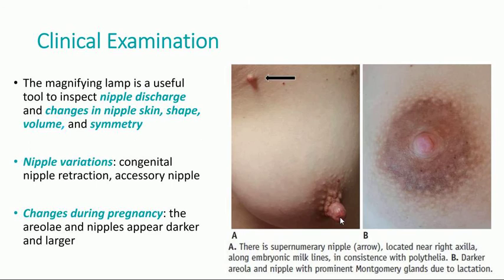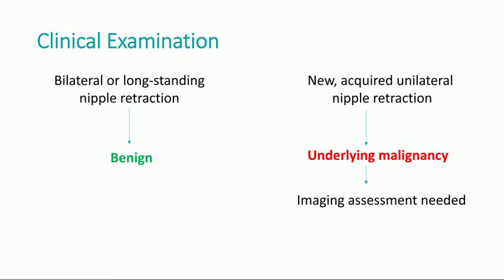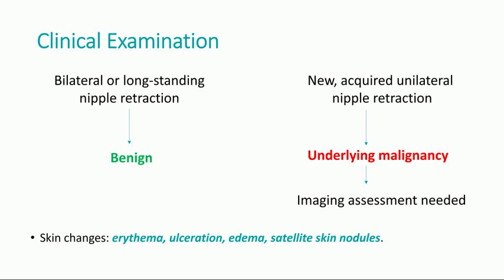Don't forget about the changes that occur during pregnancy, as in this picture where a darker areola and nipple with prominent Montgomery glands might be seen due to lactation. Characteristically, a bilateral or long-standing nipple retraction is benign, while the presence of an acquired unilateral nipple retraction implies an underlying malignancy and should be evaluated with imaging techniques. Nipple skin changes such as erythema, ulceration, edema or satellite skin nodules might also be encountered.